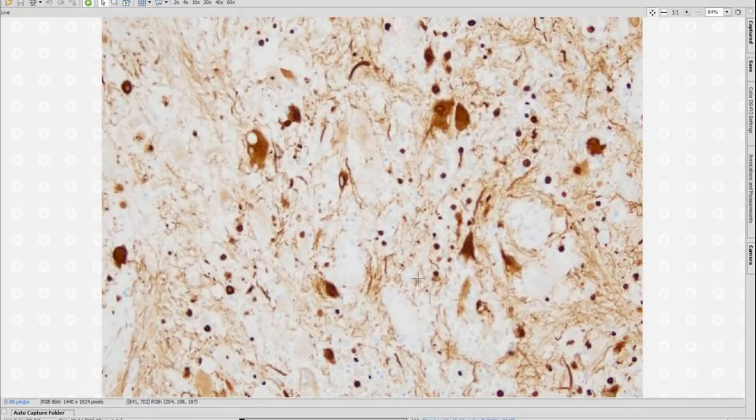So if we only focus on the adenoma, this is what recognizes the sparsely granulated somatotrophic adenoma. It's sparsely granulated because the GH can be very weak. You have very few granules, but these fibrous bodies are very highly characteristic of it. And as I mentioned to you early in the presentation, it's one of the adenoma subtypes potentially associated with more aggressive behavior. So we're having another thing.